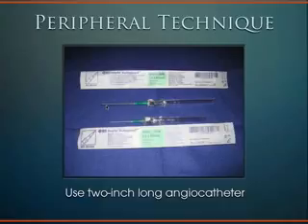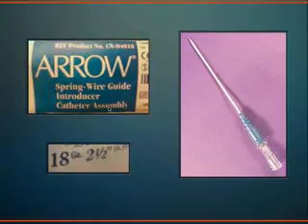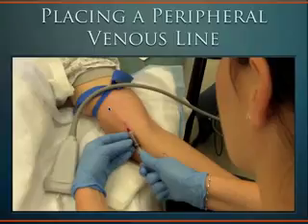You wouldn't want to use a shorter catheter, because it could fall out if the patient moves their arm around, if you had just the very tip of the catheter in. Over here you get much more of the catheter threaded into the vein. So you want to use longer angiocaths, ideally a 2-inch long angiocath. This is a really long one, 2.5 inches. You're starting to get towards the PICC line world, but a longer angiocath is what you want to use. And so once you obtain vascular access, you can set the transducer aside and then thread the catheter the way you normally would.